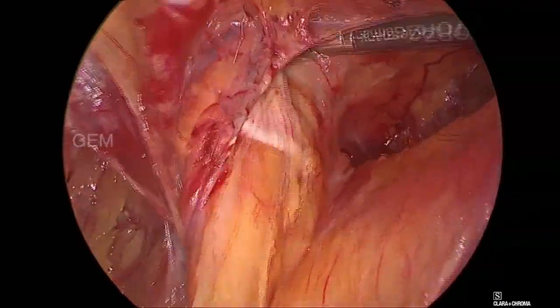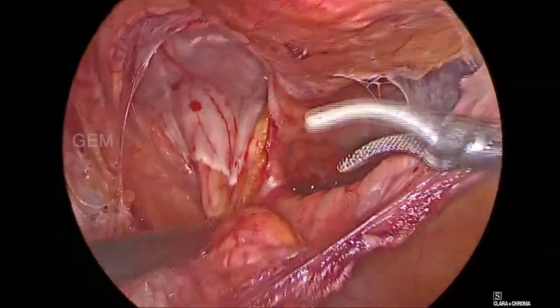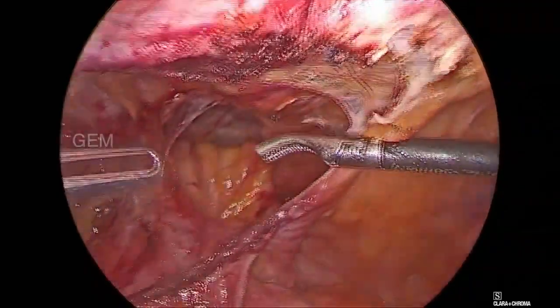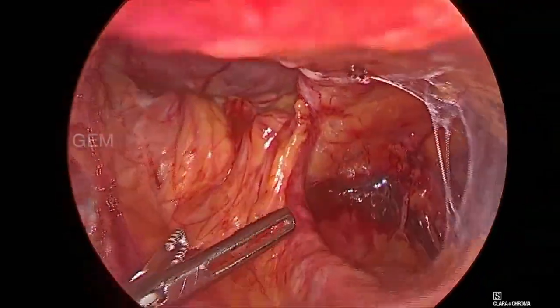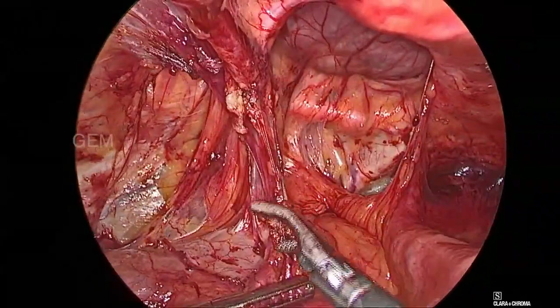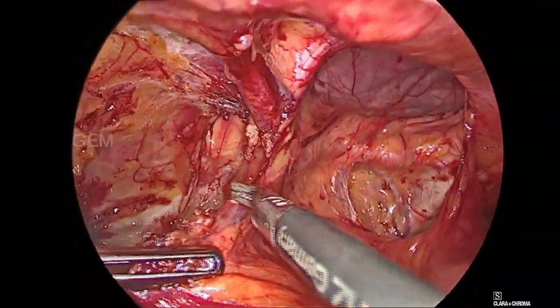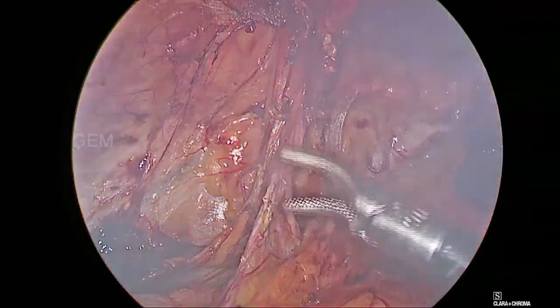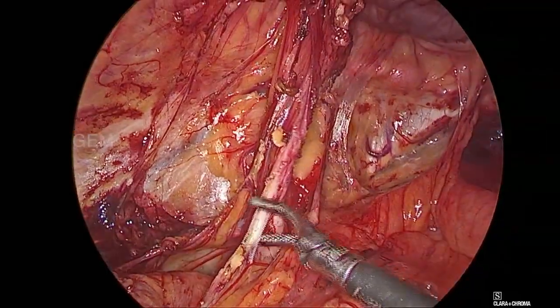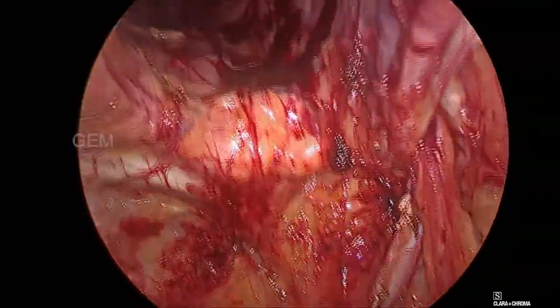Gradually we are reducing the pseudo-sac at the left side base. Dissection is done and we are trying to bare out the cord structure. Inferior dissection should go until the cord turns medially. Both side dissections are now completed and both sides have large hernia defects.